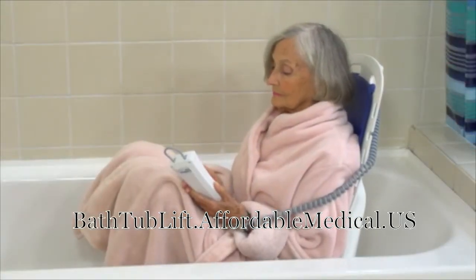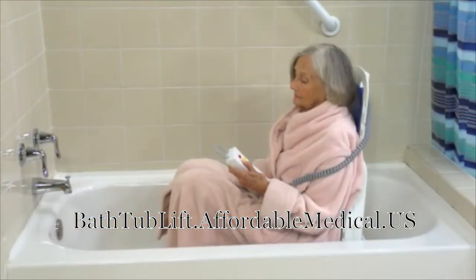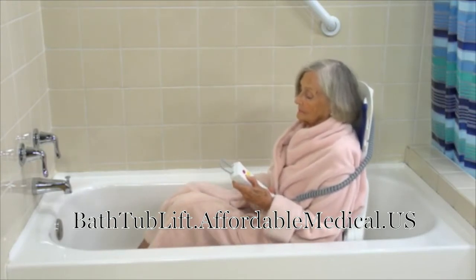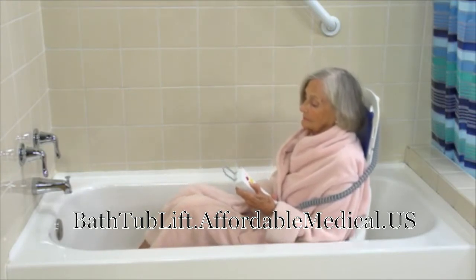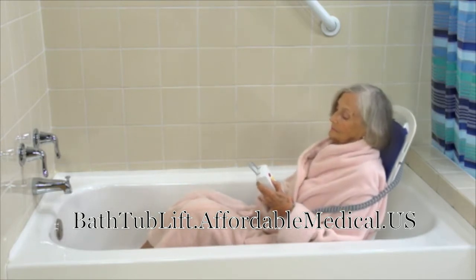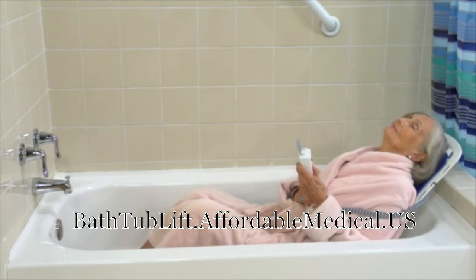Its ergonomic design, padded seat, and backrest provides greater comfort and safety to the user. A unique feature of the Bella Vita is that once lowered, the back angle adjusts independently from the lowering motion, allowing the user to sit upright when in motion. At any time, the backrest can recline to 50 degrees, so users have more room to stretch out while bathing.